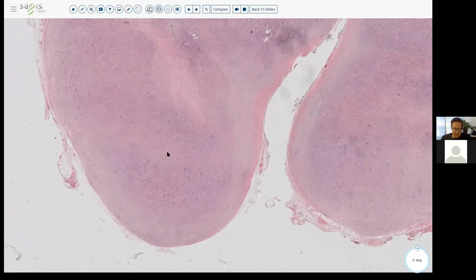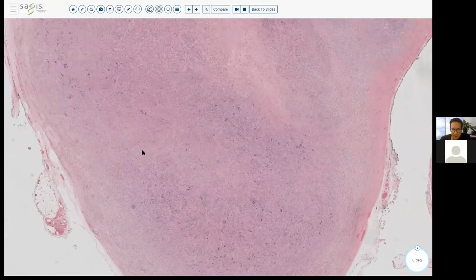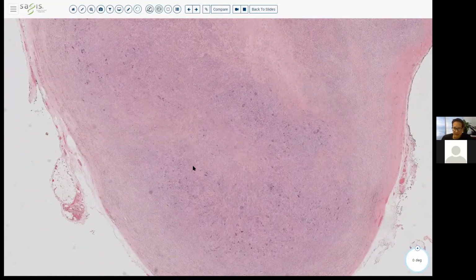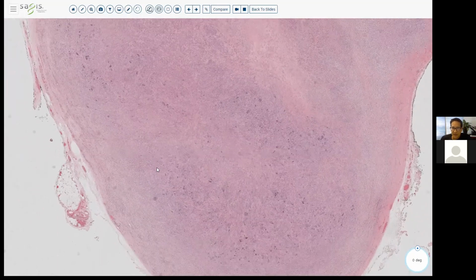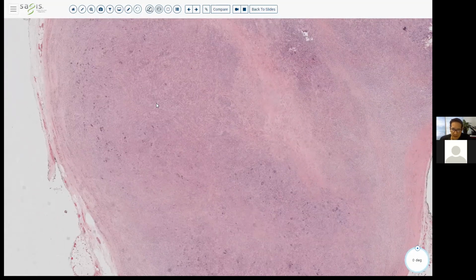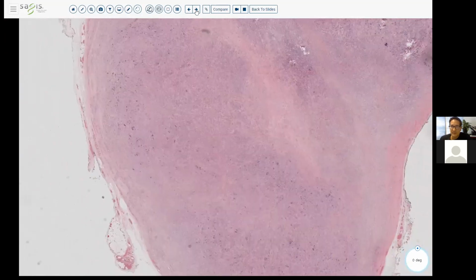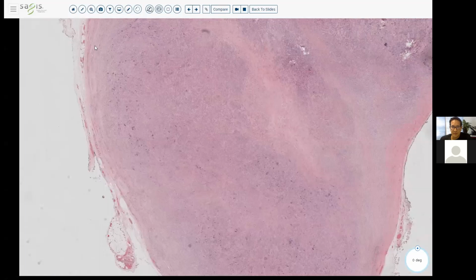If you were to stain these, the giant cells are CD68 positive. The mononuclear cells tend to be patchy desmin positive, but SMA negative. These lesions can have mitotic figures within them. That does not make them malignant. And some of the histiocytes can be foamy. And you can really get those foamy xanthomatous changes in almost any fibrohistiocytic lesion. But these giant cells really clue you into what this is. Okay. And remember, well circumscribed.